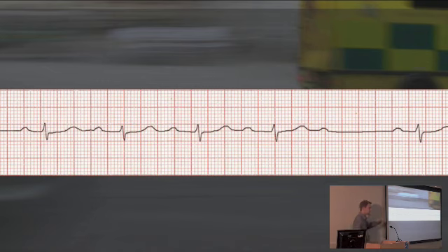And that's slightly less significant than a Mobitz type 2. In fact, some athletes have that. One of our consultants, who's a really keen cyclist, came in to work one day with some palpitations, so recorded an ECG, and he found he had Wenckebach on the ECG. So he proudly showed it to us all, because Wenckebach. You know, athletes get this.